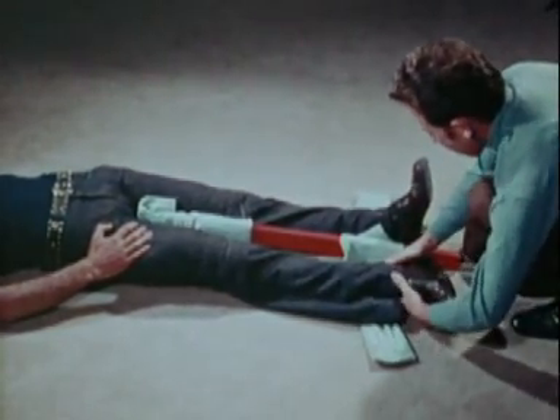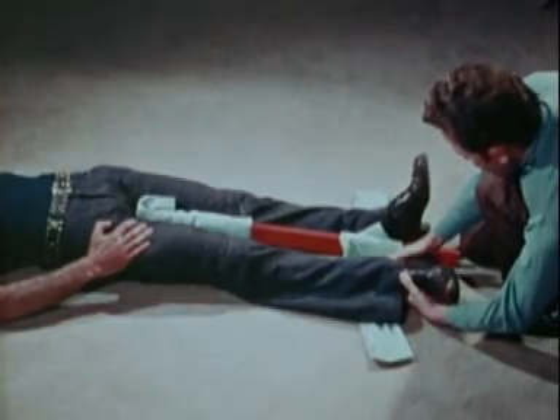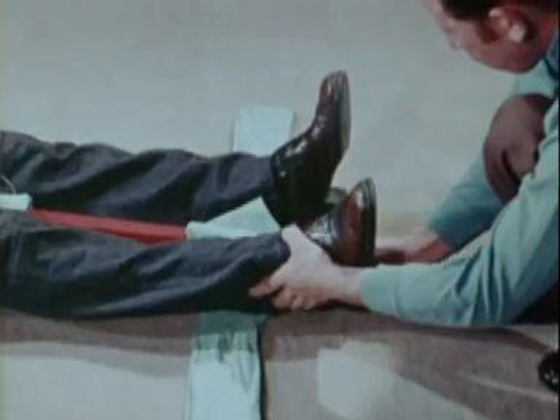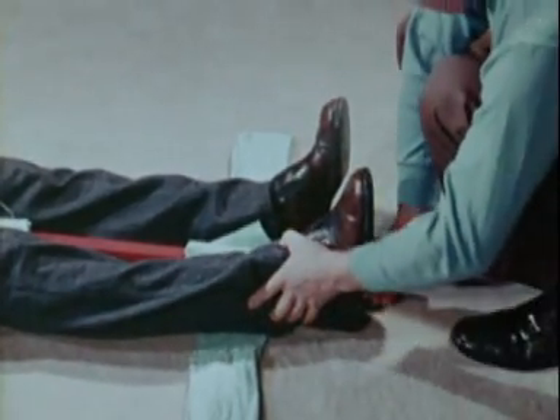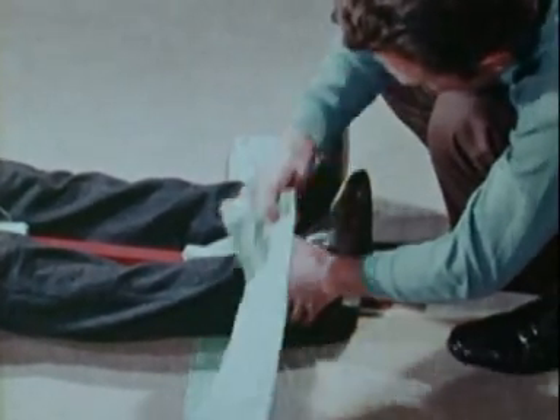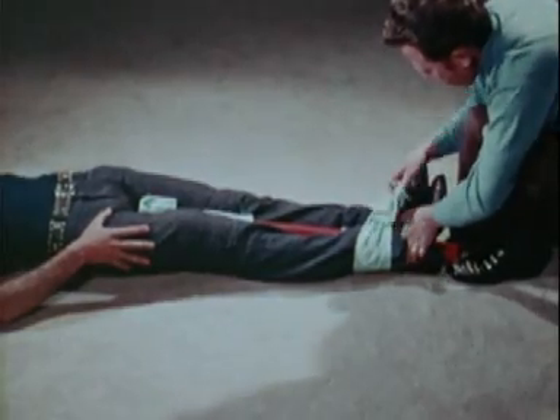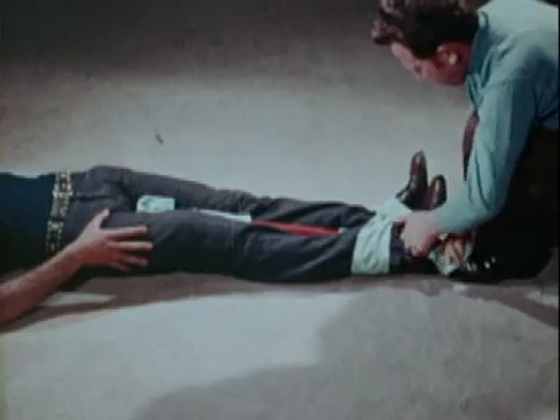Take firm hold of the injured limb and exert traction on it while carefully turning it back into its proper position. Hold the splint in place with the bandage already prepared, tying it in figure of eight fashion round the ankles and feet.